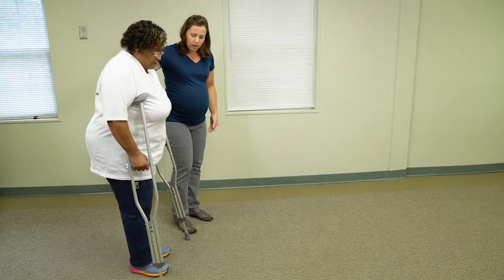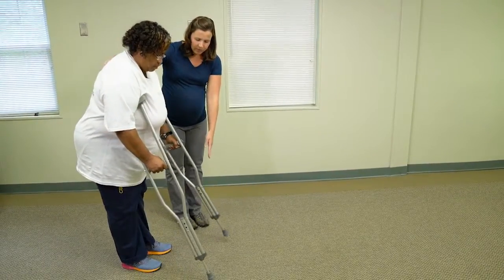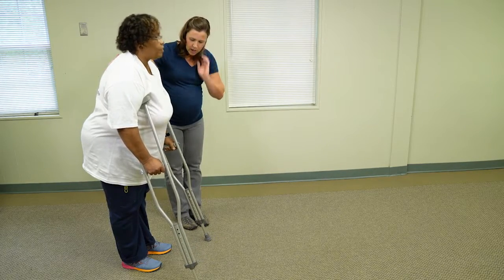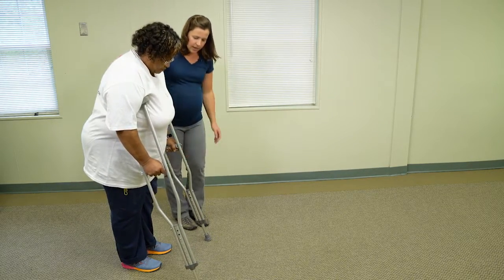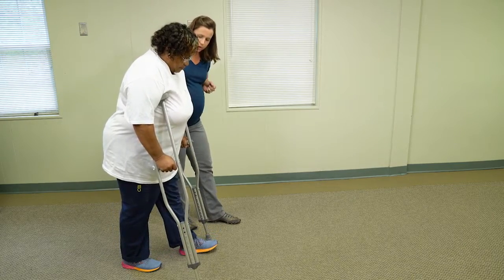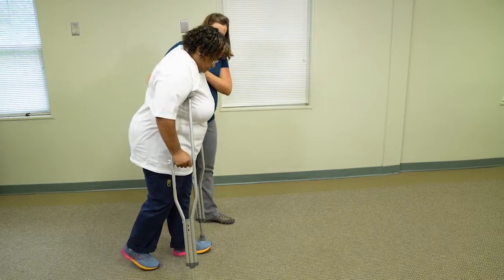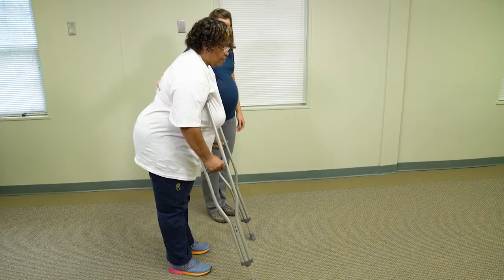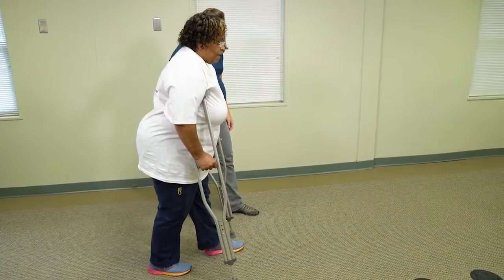Let's try that. So let's put the crutches out just a little bit in front of you. You don't want to put them too far. Okay, how about right there? That looks great. So let's go ahead and take a step with your affected leg. Good. Now as you push through, I want you to push through your arms. Perfect, and then take a step. Okay, let me do that again. Right here. Good. Bad leg.